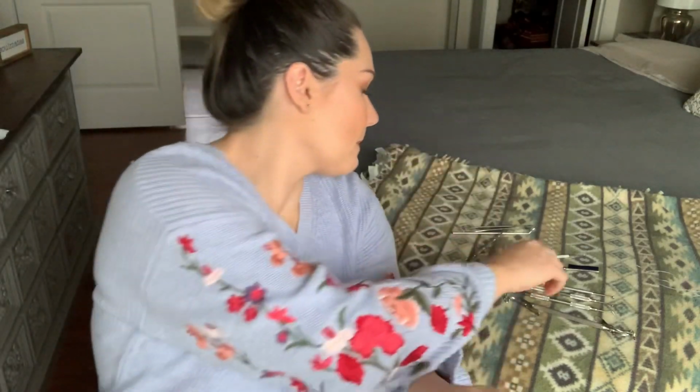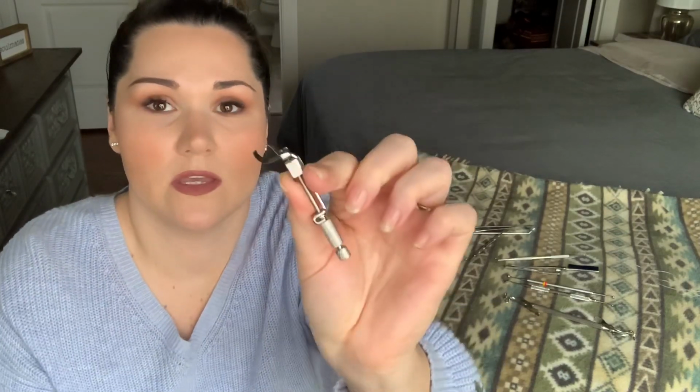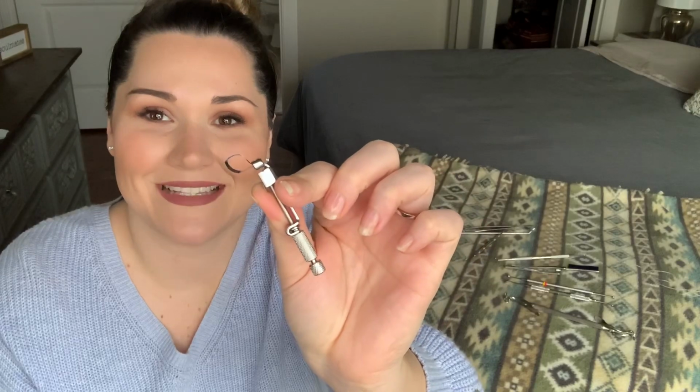And a trick for these guys too, if you can see this, beforehand, once I set it up, I always use an instrument to kind of round it out. It makes it easier for you if you're placing them, or the dentist to place them on the tooth. So nice and rounded, makes it a little bit easier.